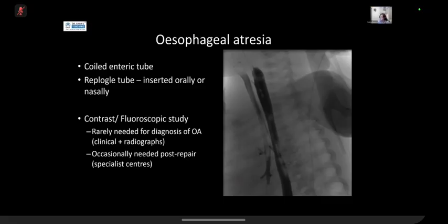No, I think in my trust we don't do tube esophagrams, so we just do a routine swallow, because the surgeons say that. Yeah, and the reason why, unless it's a very big defect, they will be worried, and that's the reason for the tube esophagram, because you want to give enough pressure, because some small tracts can be opacified with a normal swallow only if the pressure is high enough. So which is why you want direct injection of pressure. Yeah. So I think we do them in the recurrent aspirations, chest infections, the ones where we're looking for a really small tract. We'll do a tube esophagram, as Sam has suggested.